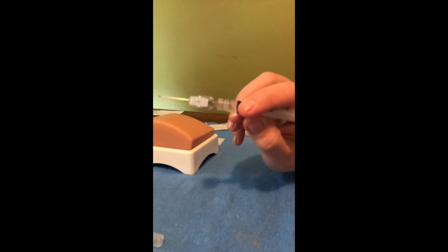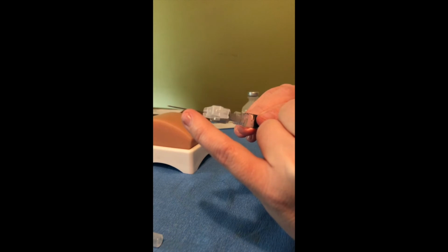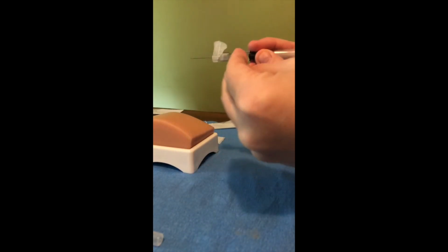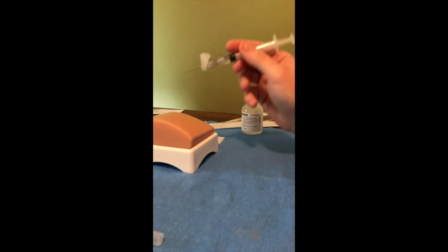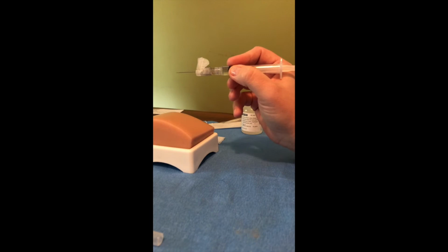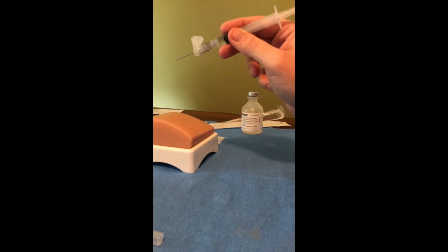All right. Bevel's going to be facing up. The little hole, I don't know if you can see it or not, but it's going to be facing up. The medicine is going to come out there and distribute. So I kind of hold this just like a little dart. I know that's what I tell everybody. Kind of like we're throwing darts. It's one little quick motion.